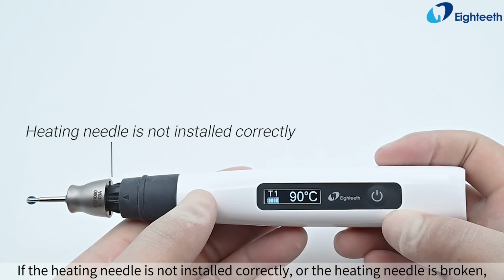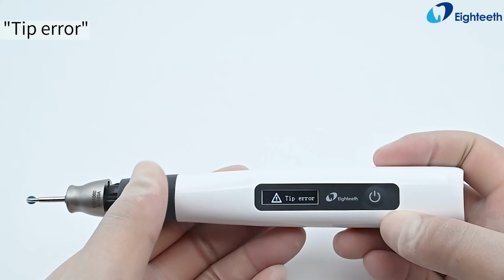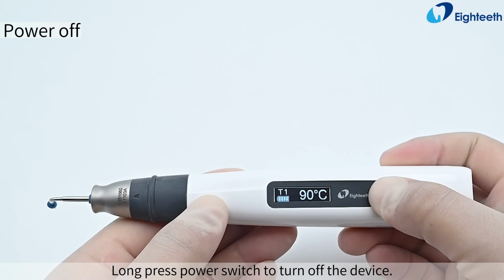If the heating needle is not installed correctly, or the heating needle is broken, tip error reminder will appear. Long press power switch to turn off the device.